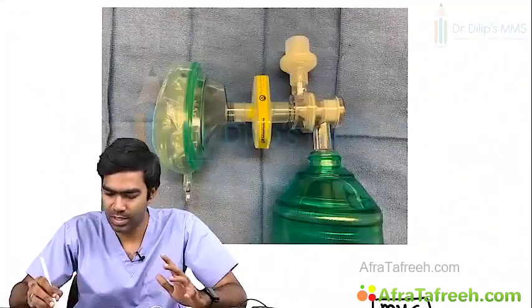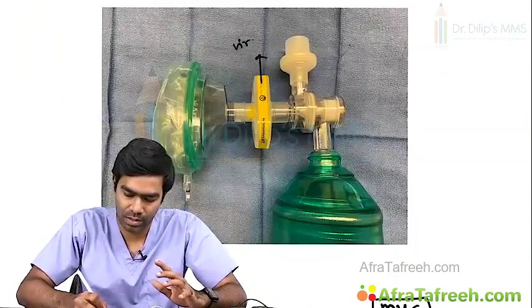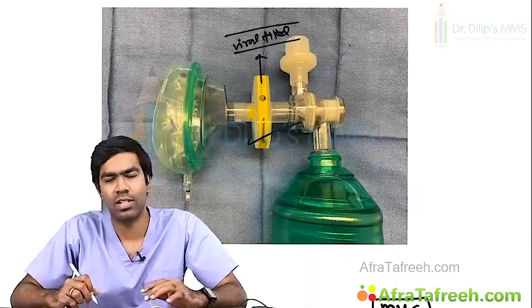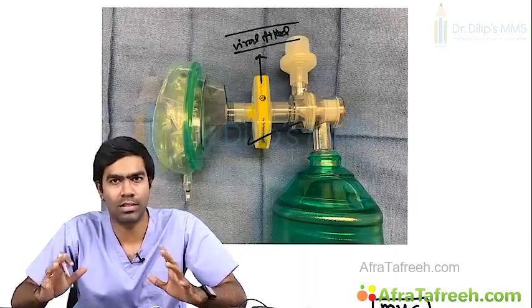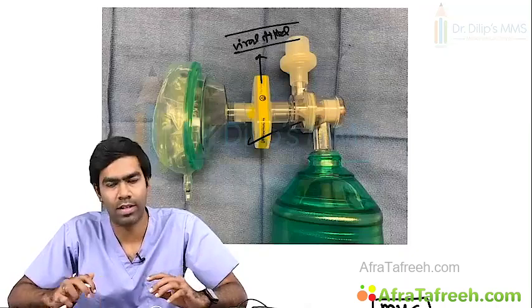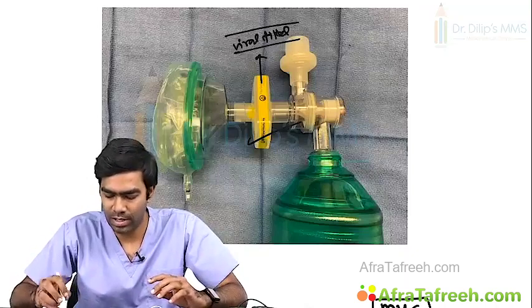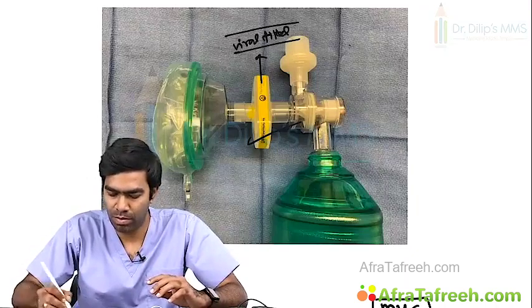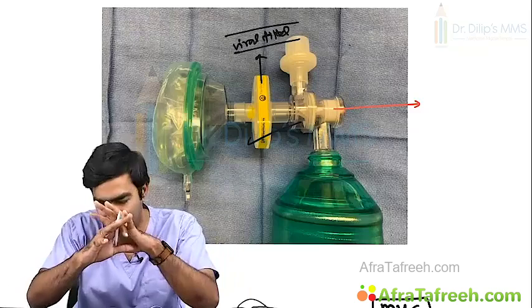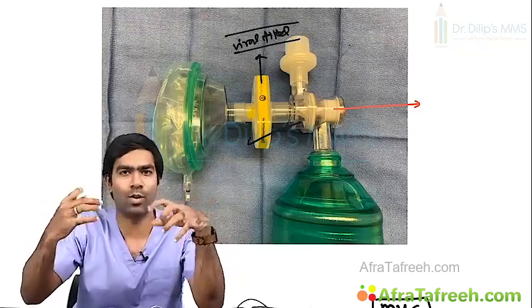So this is the viral filter. This is the viral filter here, which is important in the current season as well. This has to be known. This yellow color thing, what I've shown, is the viral filter there. And you can see this is the pop-off valve here. This is a different device. I think this is a Mayo device. I mean, arrangement mechanism is the same, but where they are located might be different.